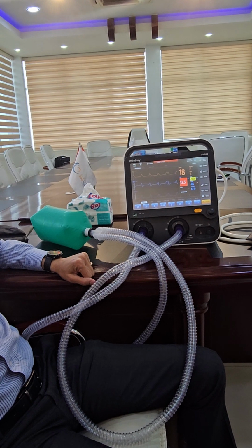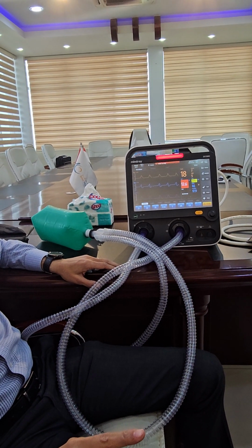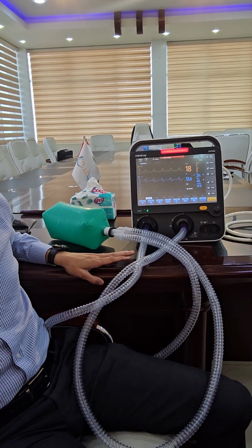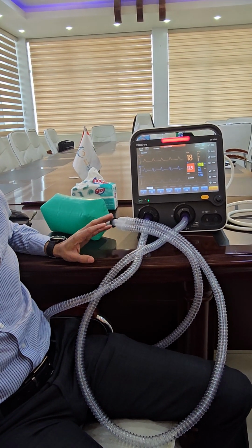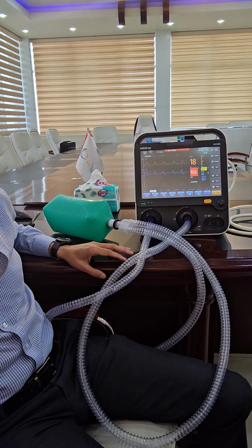So we have control variable, what does it give you? Type of ventilator. Control variable gives you type of ventilator. Please repeat with me so you don't forget. Control variables give you type of ventilator.